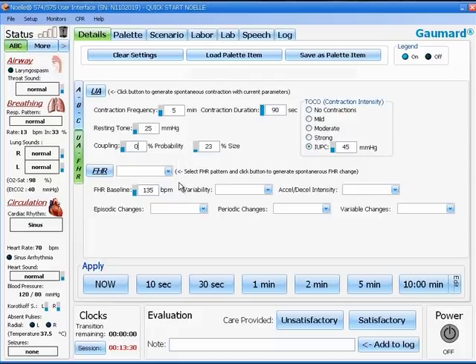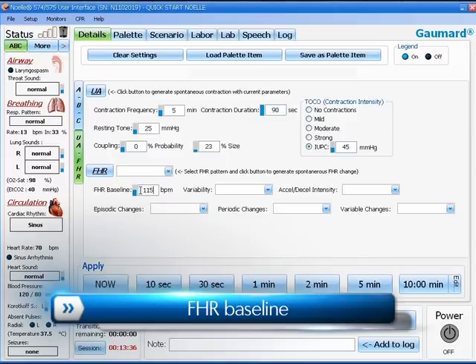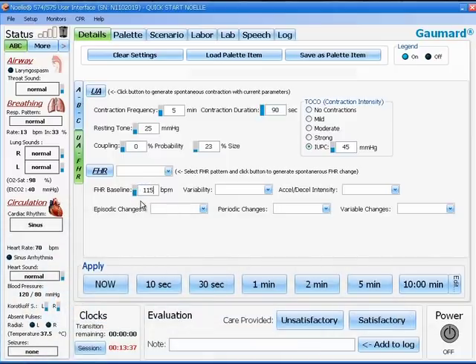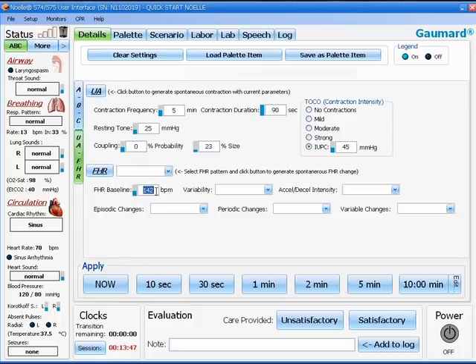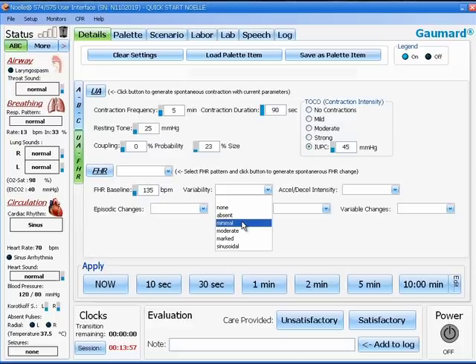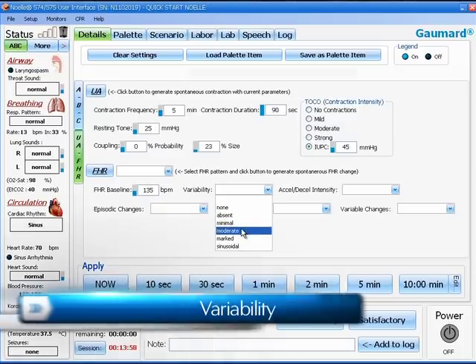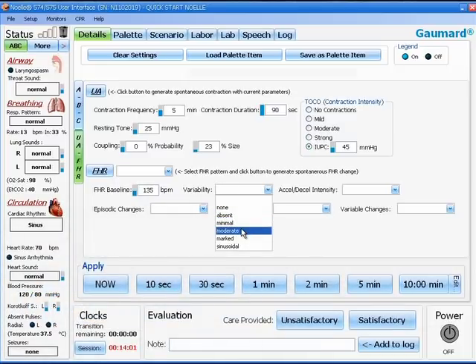For the fetal heart rate controls, you must first set a fetal heart rate baseline which is the first box on the left. Again, we can use a slide control at the side or set in a numeric value. Somewhere around 135 is a normal value. Moving over to the right, we have our first drop-down box, and here you must set the variability, such as minimal or moderate.